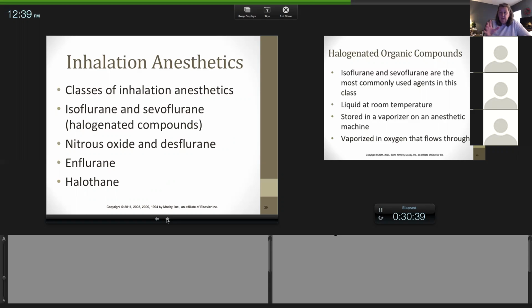Now, you guys are lucky. With the non-rebreathing systems, there was a little adapter. You have a little pressure manometer between the exhale tubing and the bag. That was an extra adapter that was ordered. I don't know if every clinic you go to will have that. So sometimes when you bag a cat, you don't have the pressure manometer on the anesthetic machine because you're bypassing all of that. Sometimes you have to just go by feel.